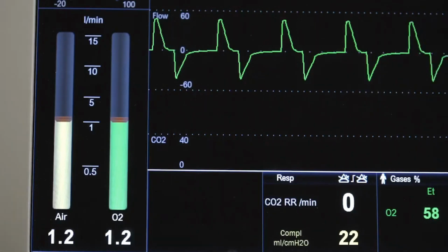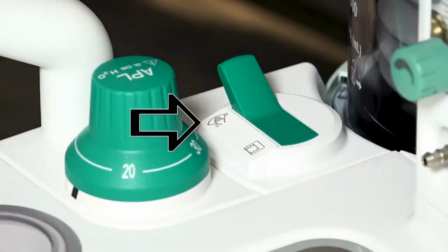Anesthesia devices are not automatically configured to begin mechanical ventilation when a case is started. The devices are configured for both manual ventilation, often referred to as bag mode, and mechanical ventilation. When the device is in bag mode, the device is not providing any ventilation support to the patient.